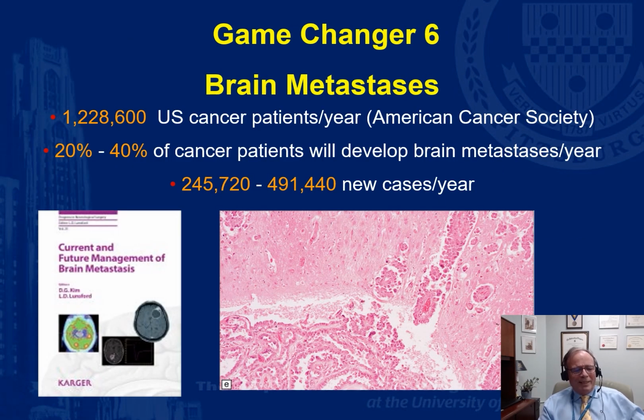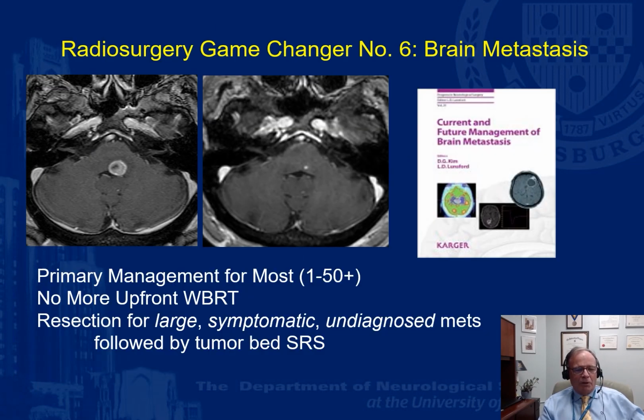Number one indication across the world really is its role in the treatment of brain metastasis. This has opened the door for neurosurgeons to have extensive additional experience in the management of this problem, rather than just conventional radiation therapy or just craniotomy and removal. There's been a great deal of information written about this. It has a very high chance of long-term tumor growth control and can be used for solitary or multiple brain metastasis with equal long-term control of the treated tumor volume.